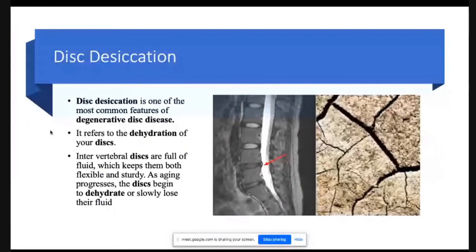So let's make a simplified form of all these MRI impressions, so that we can interpret them, understand them, and give our best treatment for all these clinical conditions. Okay, coming to the term disc desiccation. See, in the word disc desiccation, disc is referring to the intervertebral disc. On the right side, I have put one MRI picture; the second part is analogous to this.